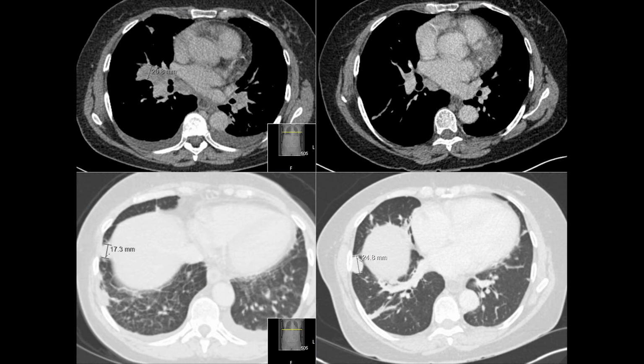In this example, the patient has developed a right hilar mass, left hilar adenopathy, numerous new pulmonary metastatic lesions, and bilateral pleural effusions since the nadir scan. But by modified RECIST, this remains stable disease, and the hilar mass is merely added as a target, and therefore will contribute to a possible progression at the next visit if it continues to grow.